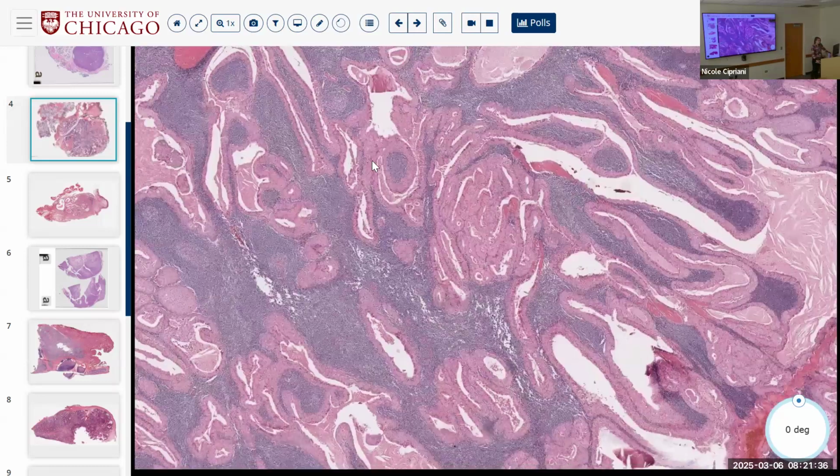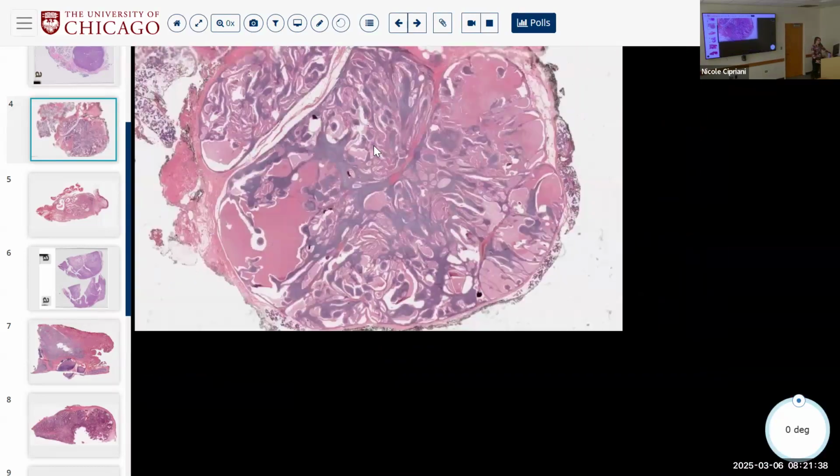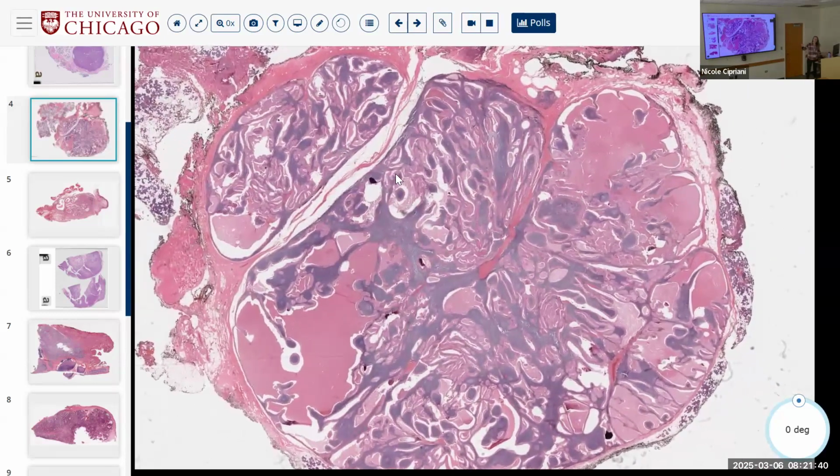Maybe, right? My theory is that this isn't even a neoplasm, which we can't prove, we've never proven that this is neoplastic or clonal. Maybe this is all just some kind of exuberant ductal proliferation, and maybe that's why you have this epithelial bilayer, because it's recapitulating the ducts. So I don't know, that's just my theory.